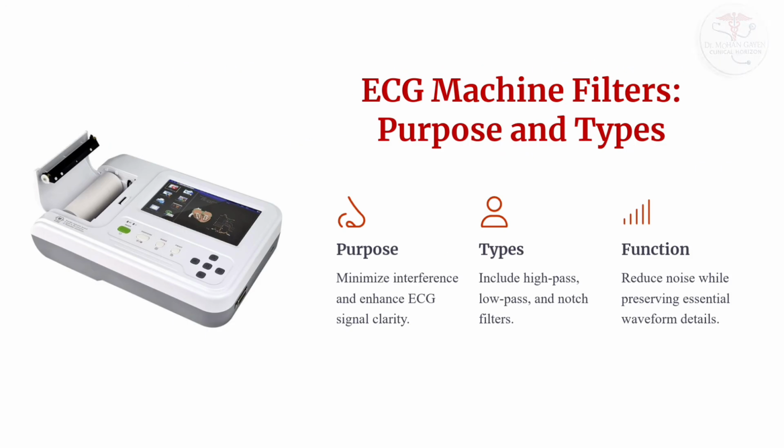ECG machine filters. Purpose and types. ECG machines use filters to improve signal quality by minimizing noise and artifacts. High-pass filters remove slow-moving baseline shifts, while low-pass filters eliminate high-frequency interference. Notch filters specifically reduce electrical noise from power sources, 50 to 60 Hz. Understanding filter settings is crucial to ensure that clinically significant ECG waveforms are preserved while reducing background interference.